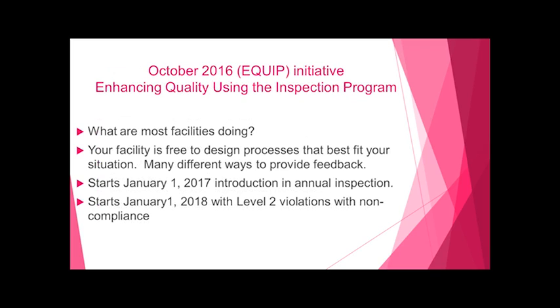It was introduced in October 2016. What are most facilities doing? We're going to talk about that. Your facility is free to design processes that best fit your situation. Maybe you're just a diagnostic facility. Maybe you're just a screening facility. Maybe your radiologists aren't even at the facility that reads the images. They could be outside radiologists, or satellite from a hospital, little clinics. So there are many different ways to provide feedback. So that's good. They give you leeway in making your own program.